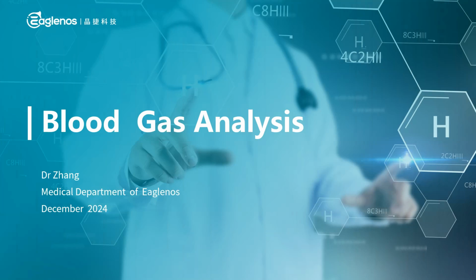Hello everyone, I'm really pleased to have the opportunity to share with you today an important clinical topic: the clinical applications of blood gas analysis. Blood gas analysis is a fundamental yet crucial diagnostic tool that we frequently use in daily clinical practice. It not only helps us understand a patient's respiratory and metabolic status, but also provides vital information regarding acid-base balance, oxygenation, and ventilation. Whether in critical care, emergency medicine, or specialties like respiratory and cardiovascular medicine, blood gas analysis plays a key role in guiding treatment and monitoring patient progress.